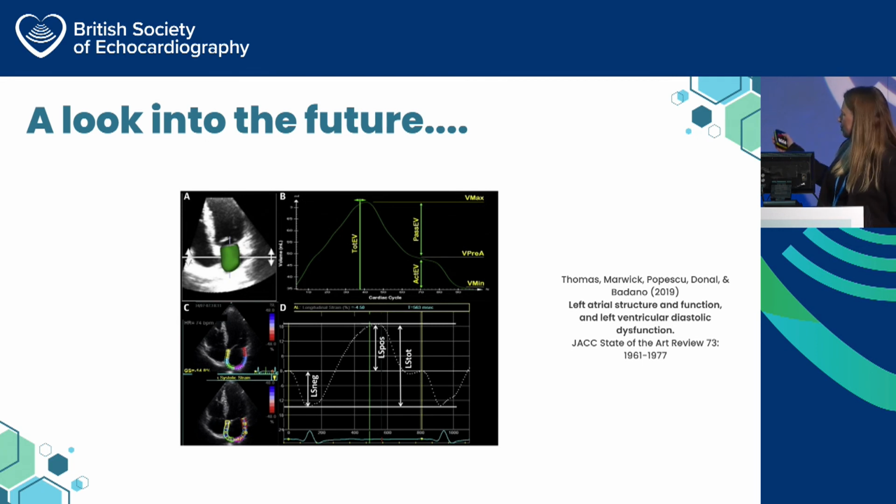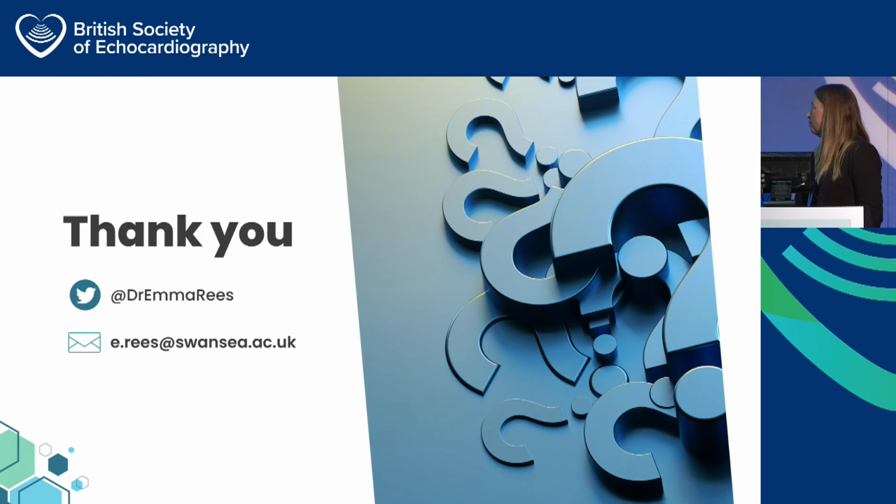I would encourage you to look at this state-of-the-art paper that was published in JACC in 2019, which looks at the rationale for 3D quantification, strain in the left atrium, etc., all of the different phases of function, if you're interested in that. And I'm looking forward to hearing what's in the new strain guidelines, because it'll be interesting to see what's in there from the left atrium.